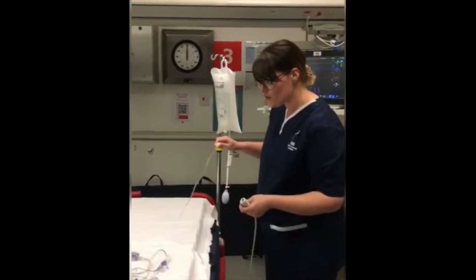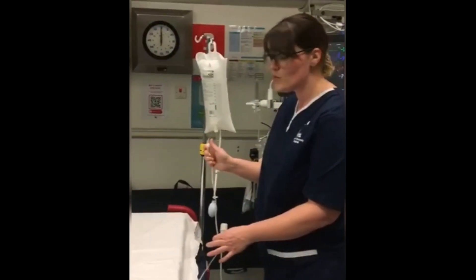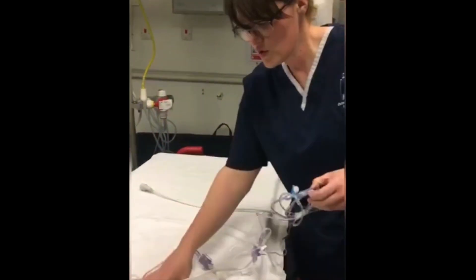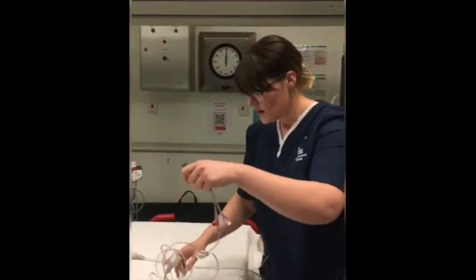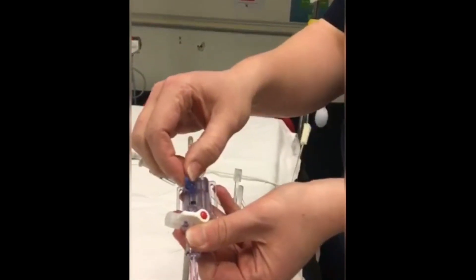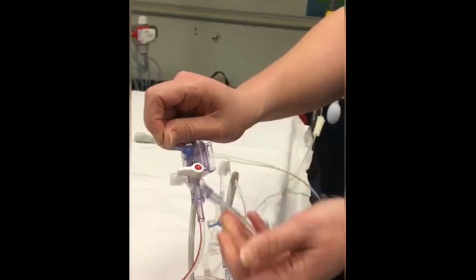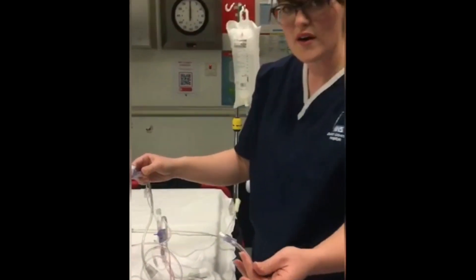Before attaching this to the patient or giving it to the doctor, you need to flush the line through. Like a normal giving set, make sure this is on. You have two different lines — we don't use the blue one, we use the red one. To flush the line through, pull the little blue toggle here and make sure there is no air in the line at all. It will come through at the end. This is now primed and ready to use.